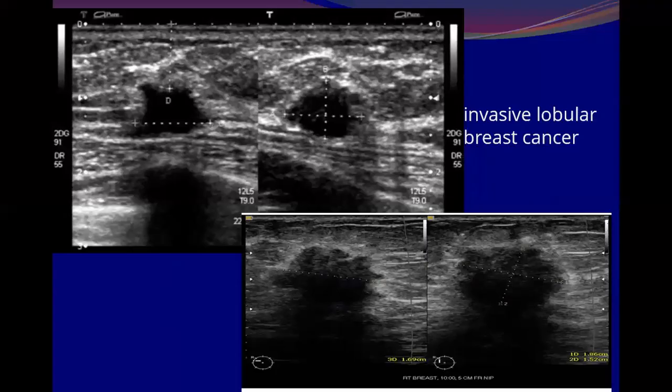Okay. So, this is one, yes, excellent, well done. More labeling of the lower one. What else?